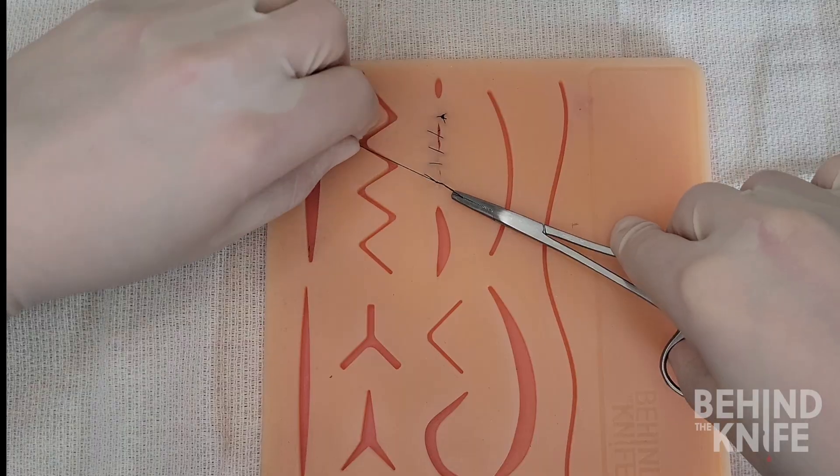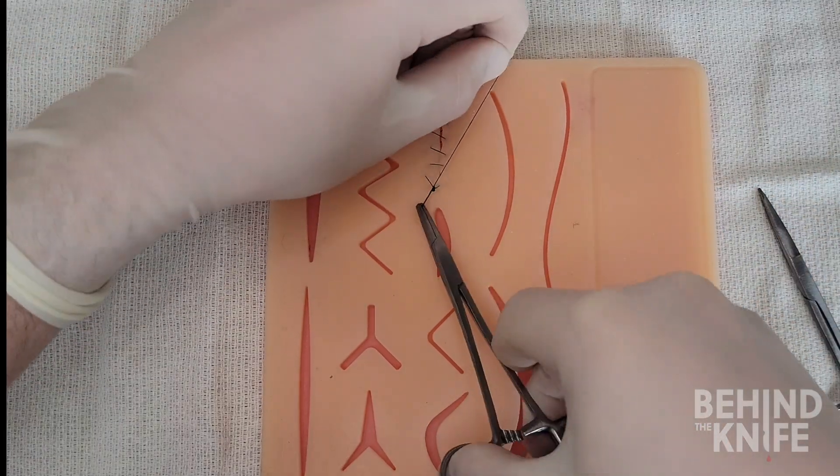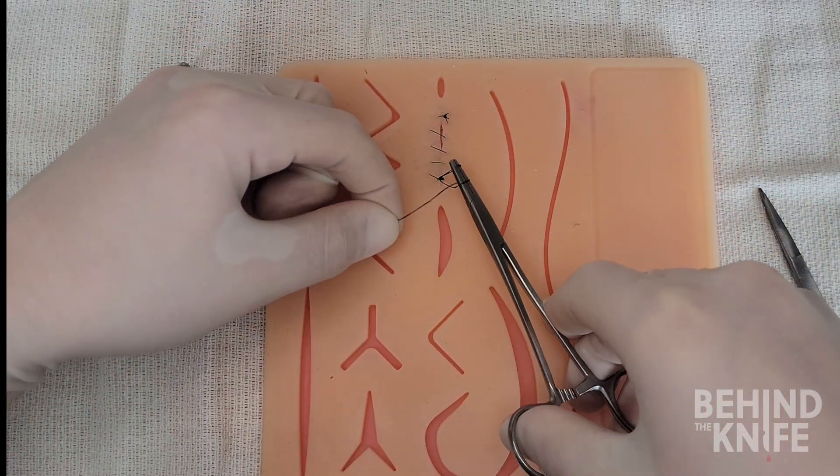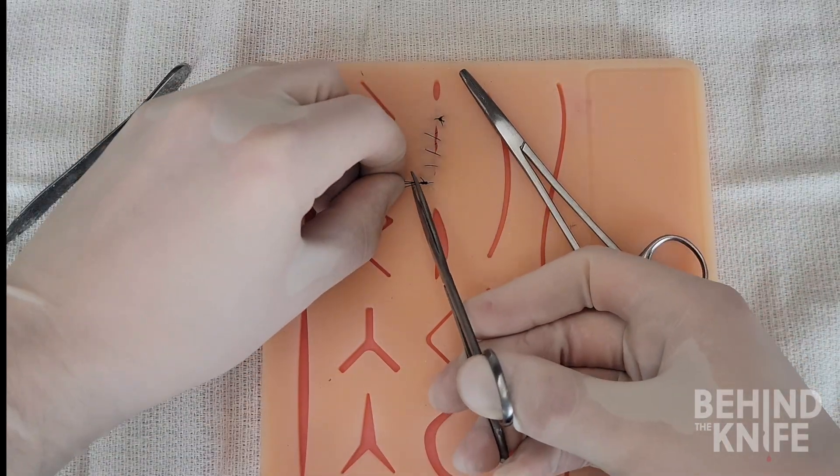The suture can then be instrument tied using the loop which will act as the short tail. Once you cut the suture here you've completed a simple interrupted suture.